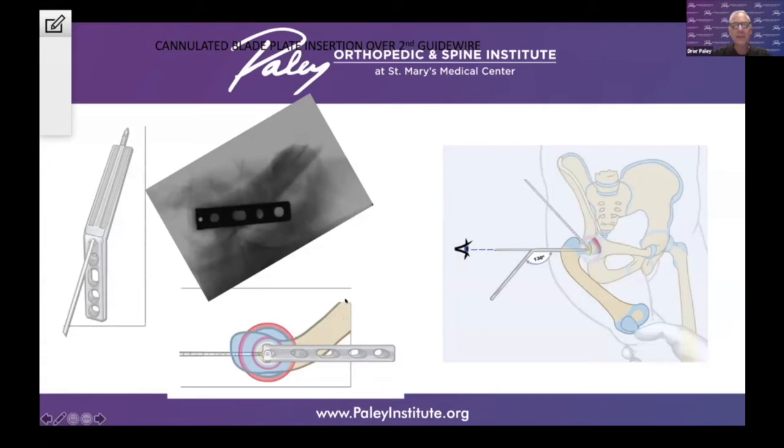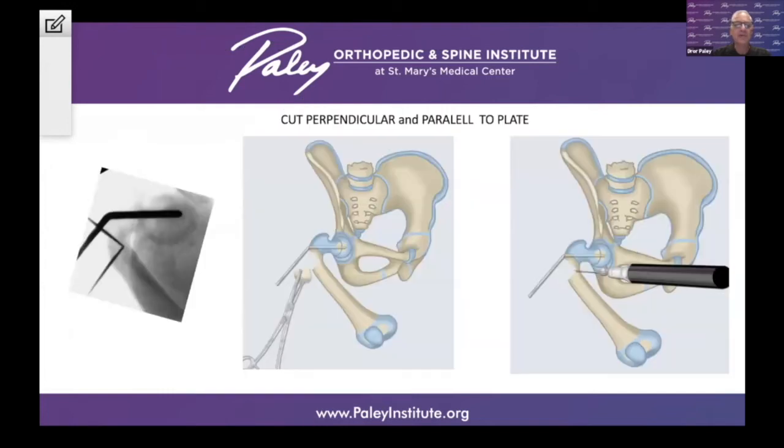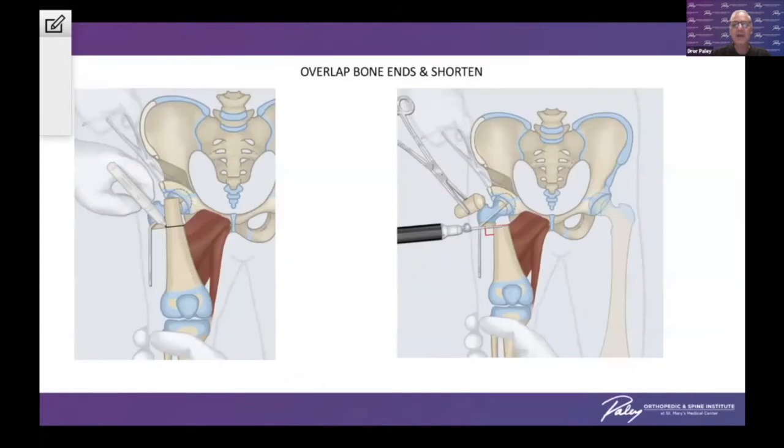We then need to match the distal femur to that location. It is a 130-degree blade plate, because that will be the normal neck shaft angle. We then make an osteotomy perpendicular and parallel to this and complete the osteotomy of the femur. We can then dislocate the bone fragments and overlap them in a bayonet fashion, shortening the femur to accommodate the tightness of the associated soft tissues. Shortening is a very important element of this treatment. We are also correcting the varus, the flexion, and the external rotation at the same time.